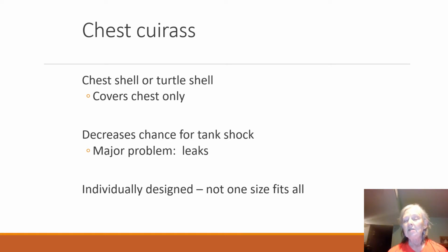Question that they asked on the boards one time was, how do you know that it's going to work? You basically make sure that you can put one hand between the cuirass and your body, and then you're going to go ahead and inflate it, and you should not have a problem. But the biggest problem with this is you still have problems with leaks. You don't have much of a chance for tank shock, but you may end up with that leak.